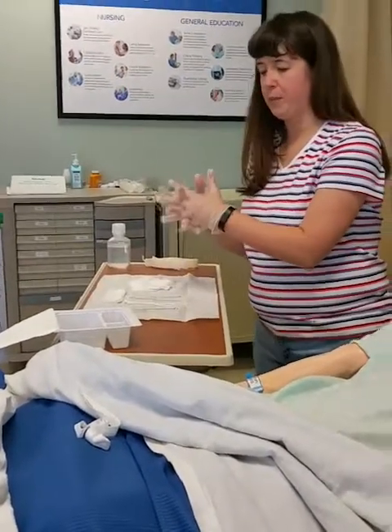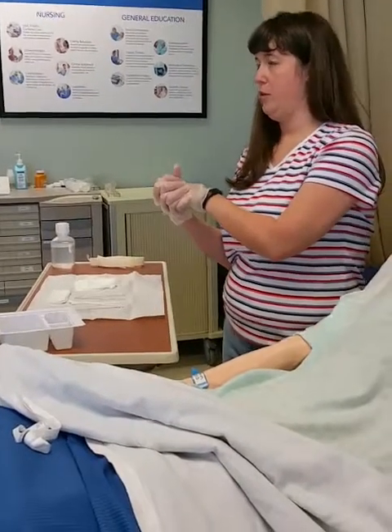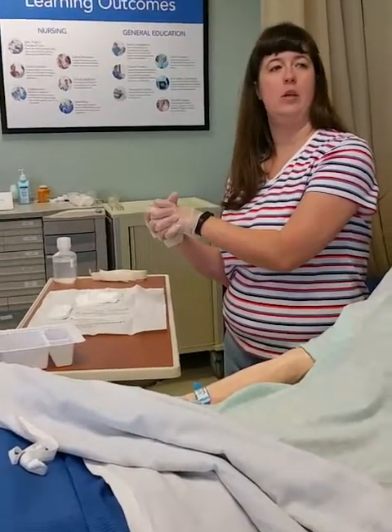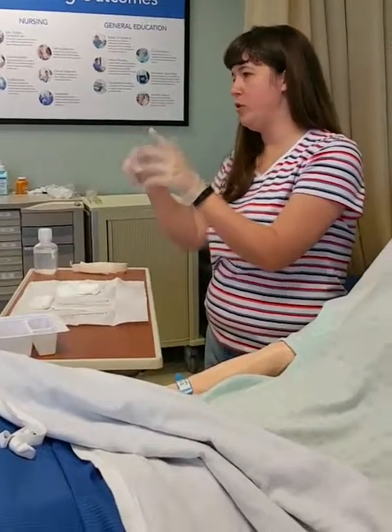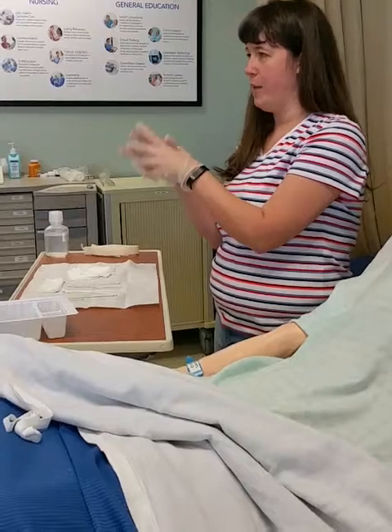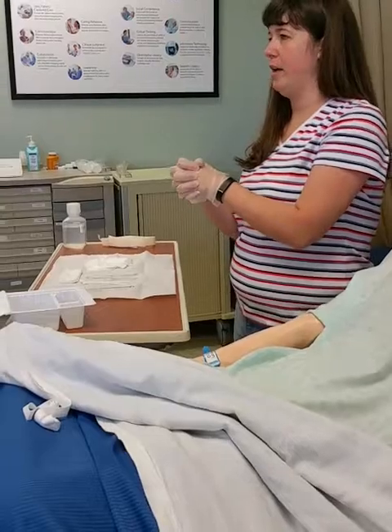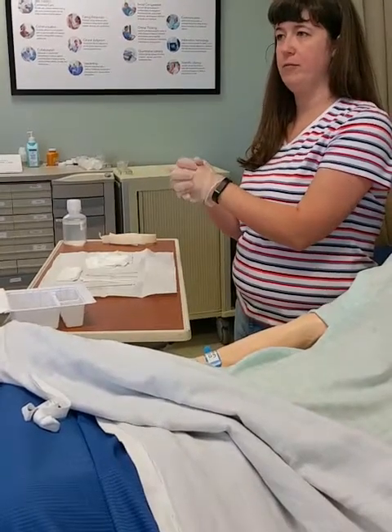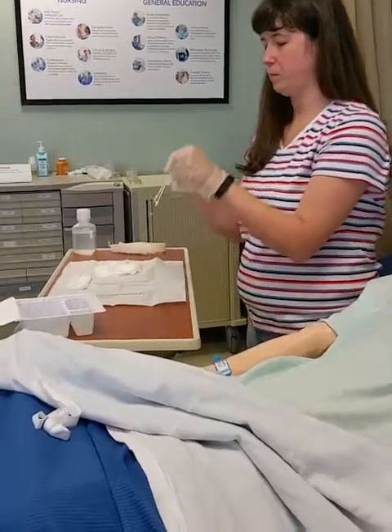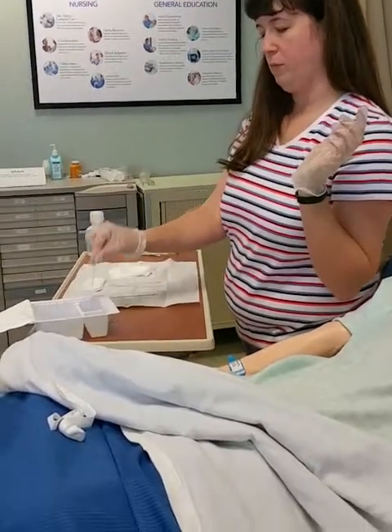4. Okay. Now, the inner cannula cleaning is sterile. The stoma cleaning is not. You want to keep it as clean as possible, but it's not going to be sterile because once you get up under that faceplate, you're no longer going to be sterile. But I want to set up my stoma cleaning supplies before I dip that inner cannula into my hydrogen peroxide, and now I have sputum floating in it. So I'm going to take one Q-tip in each, so hydrogen peroxide saline, just saline.